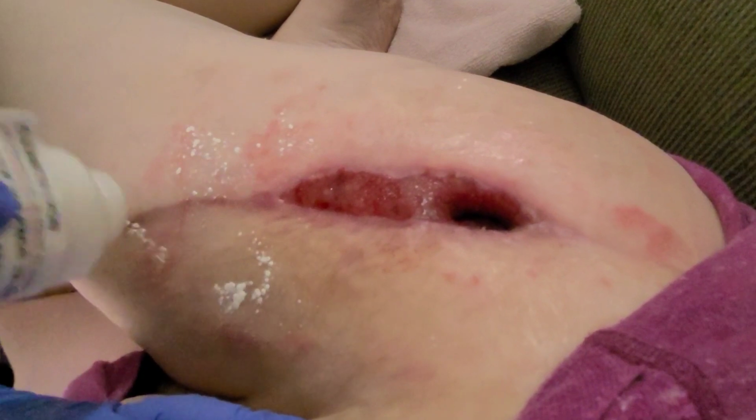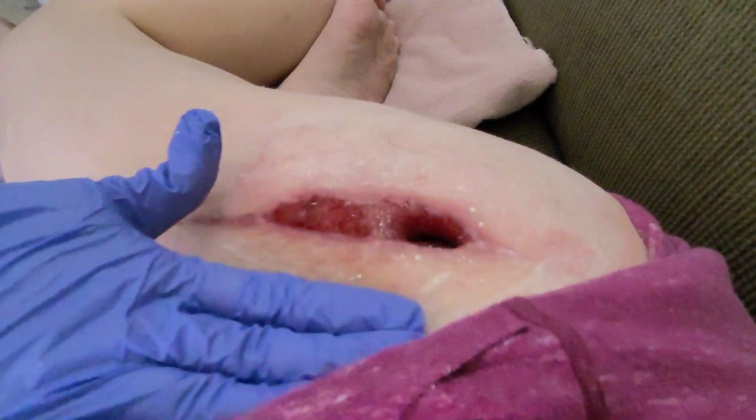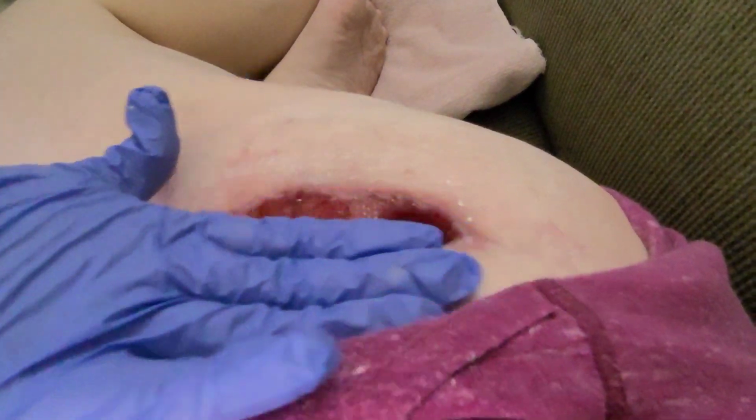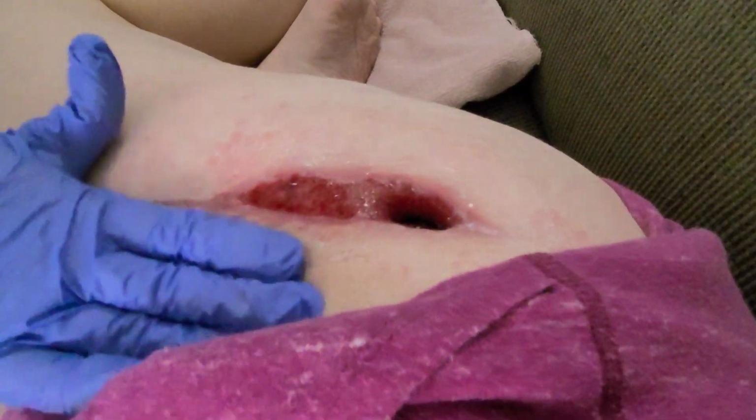So this white powder that she's putting all around the wound is a medication for the skin infection that I have developed due to the cause of the tape and everything. It's not really an allergic reaction. It's just kind of an infection because it's not able to breathe and it can get moist and all that stuff. So this is just like an antibiotic powder that we put on before we put on the sticky stuff and then the foam and the tape.